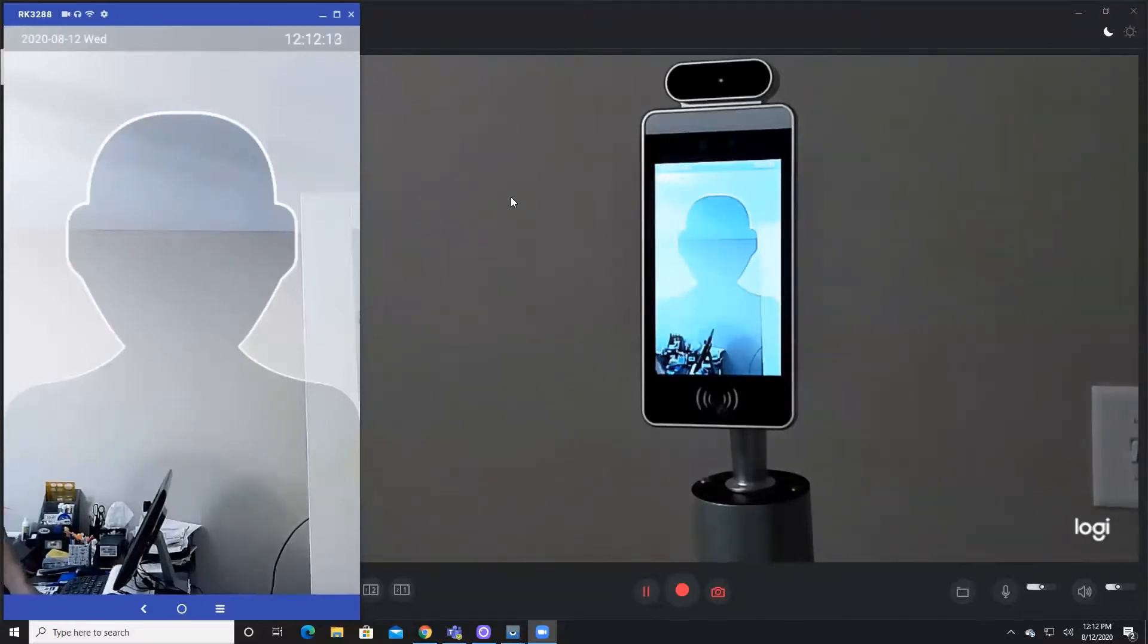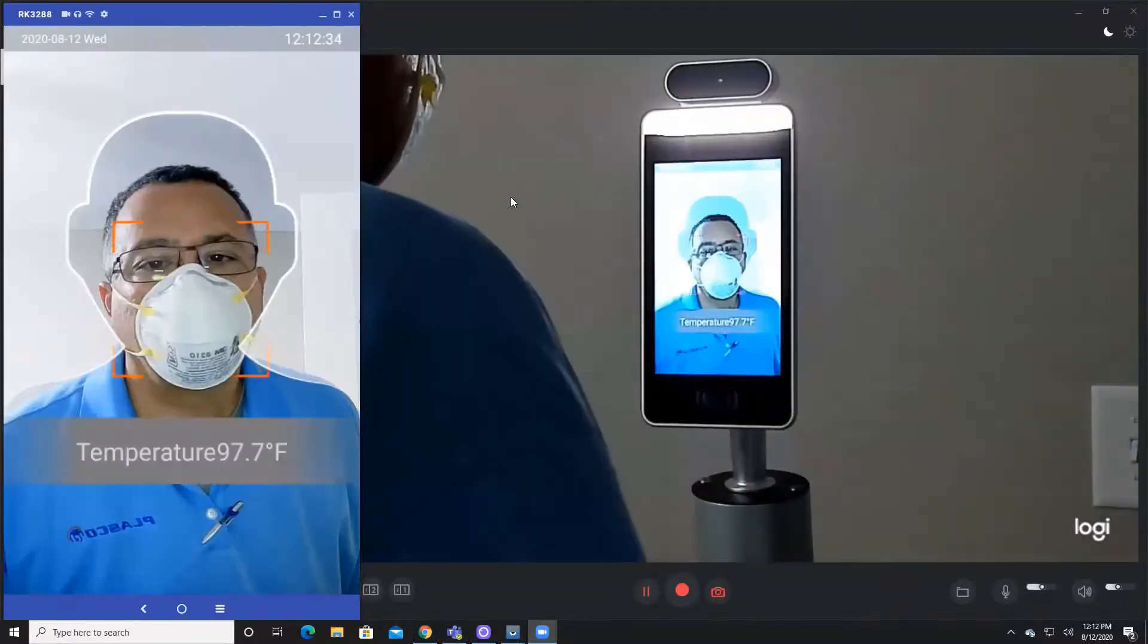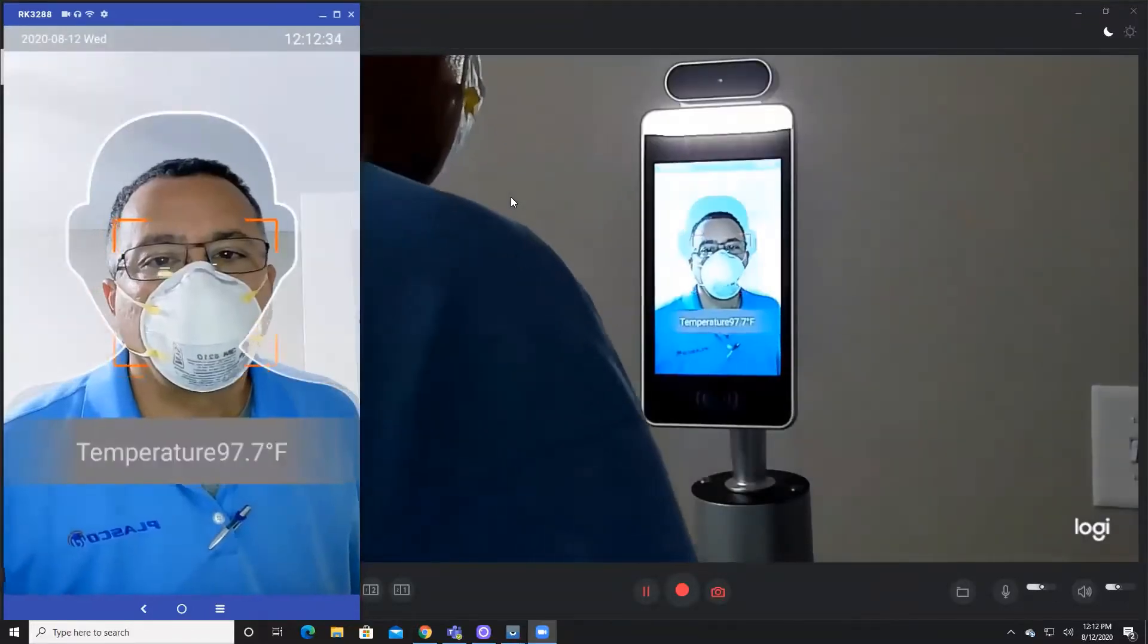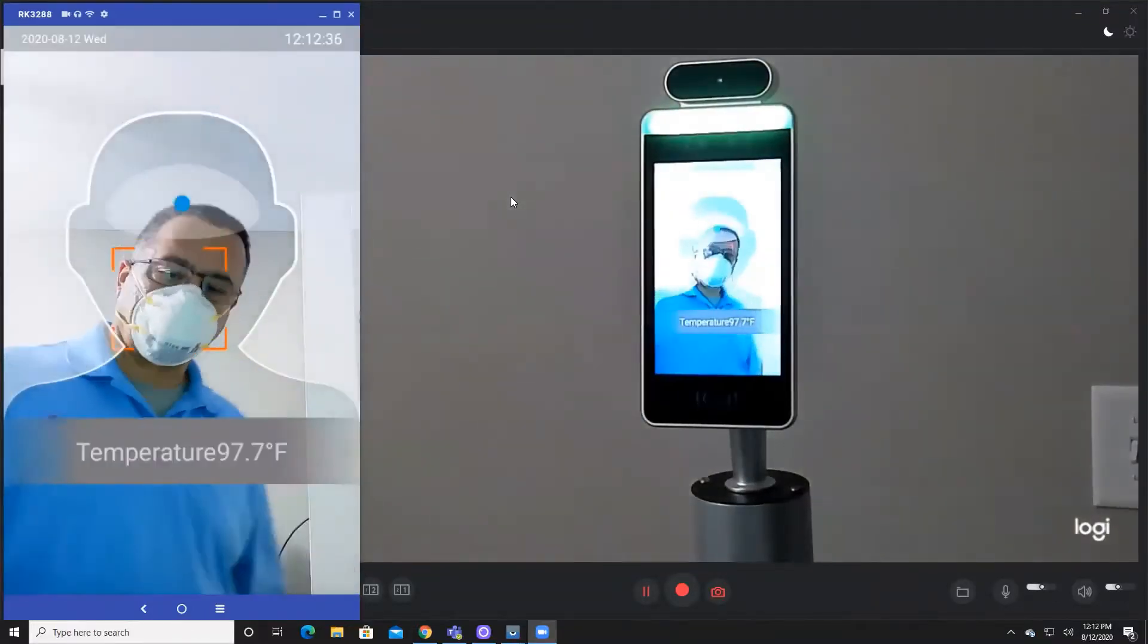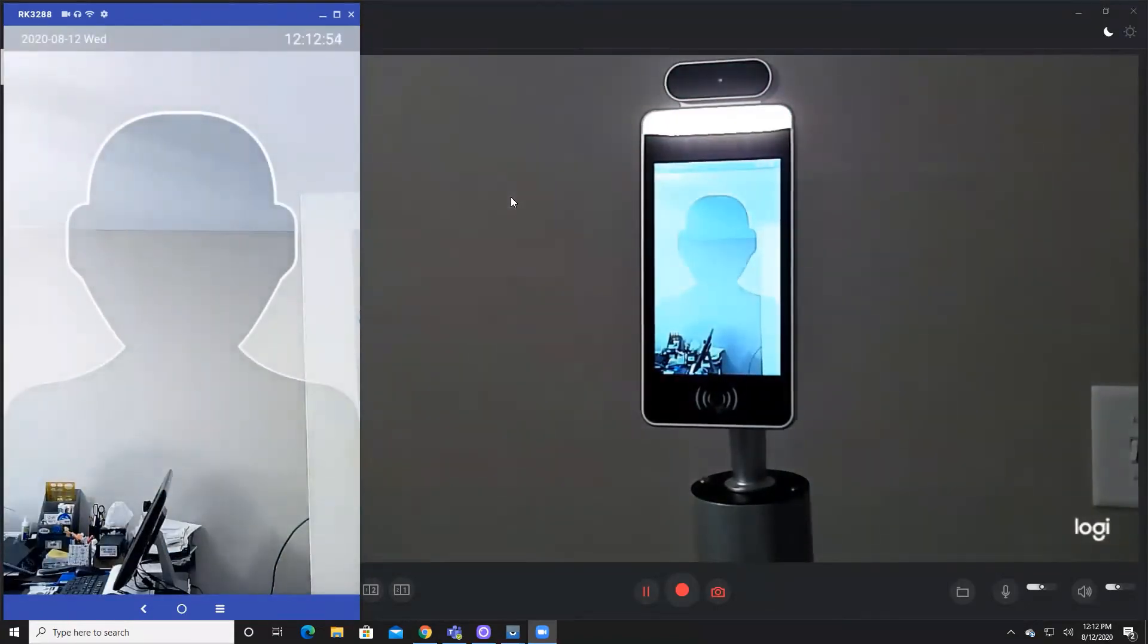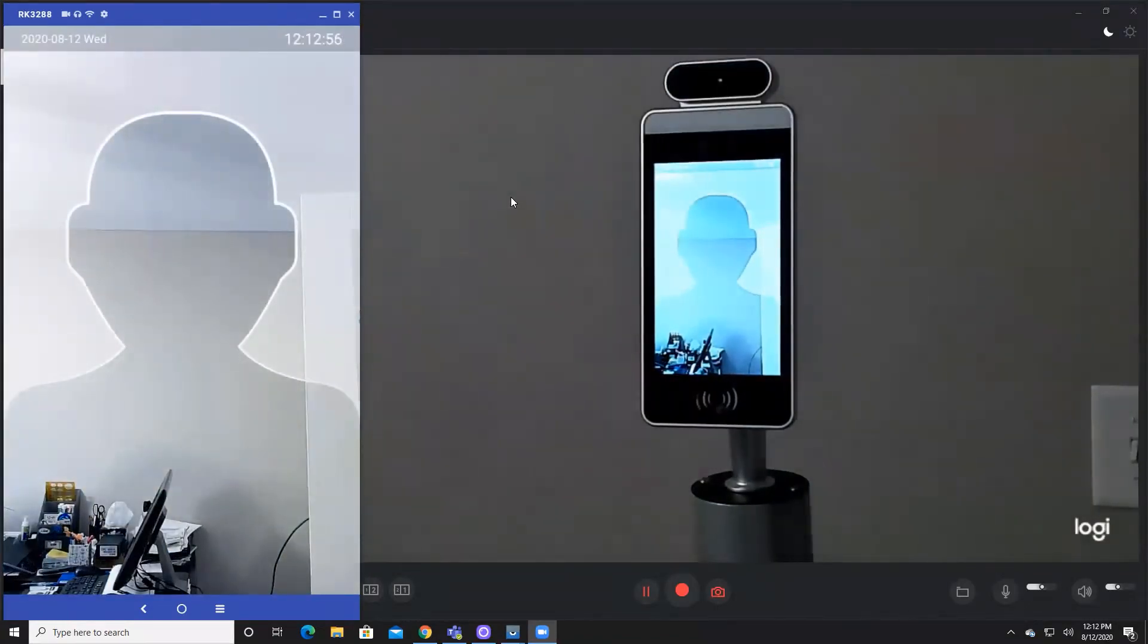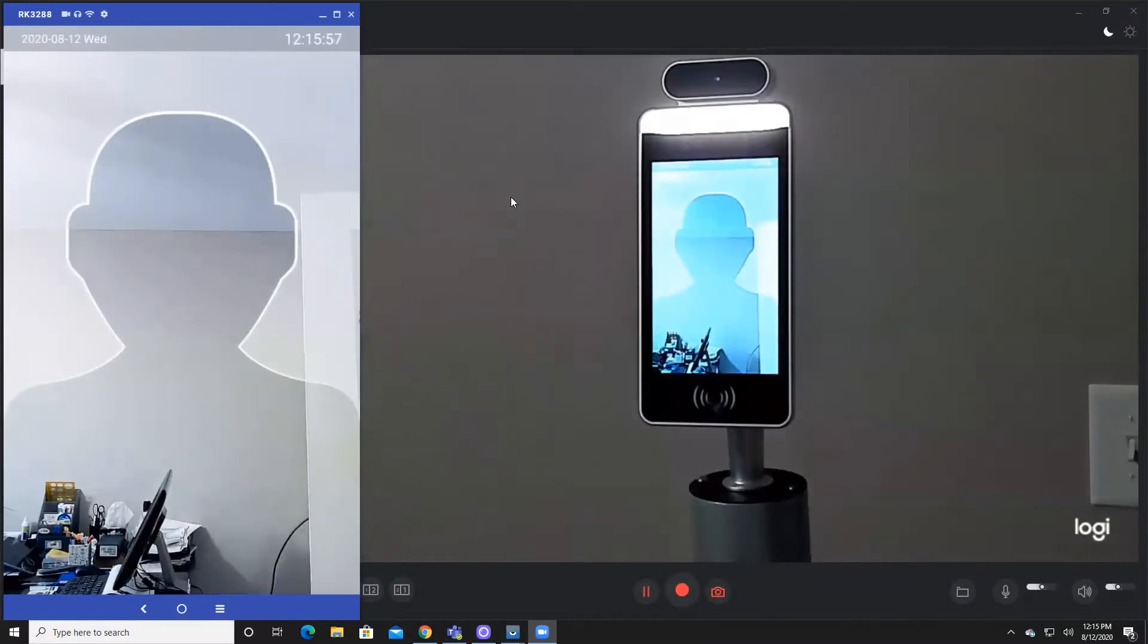But it didn't give me access, so now I will put on my mask. I previously enrolled myself in the system, so I've got a photograph of myself in there. Real quick here, I'm going to simulate a high temperature.